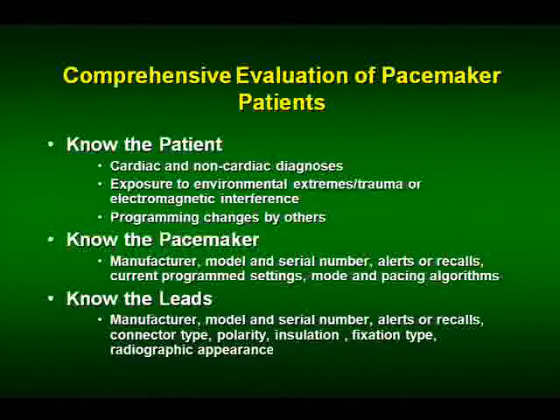Again, know the patient, cardiac and non-cardiac diagnosis. Has he been exposed or will be exposed to anything in the environment or EMI? And you can change the way the pacemaker is set. Very confusing how to analyze it, so you need a programmer. You have to know something about the pacemaker. Even just to activate the programmer, you have to know who made it. So you need to know something about that.